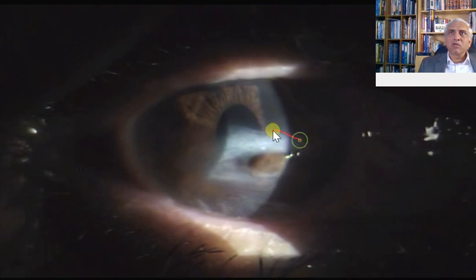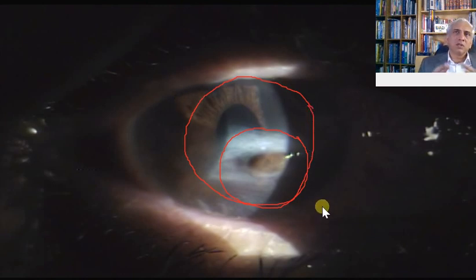You would make a trephine sort of a punch over here in this area, getting a healthy area from the surrounding area, and then getting this replaced. But if you wanted to get more of an optical result out of this, then probably you would involve the pupil in this trephine and then make a cut in the cornea like this, so that you have this area which is slightly eccentric to involve the area of the cornea.